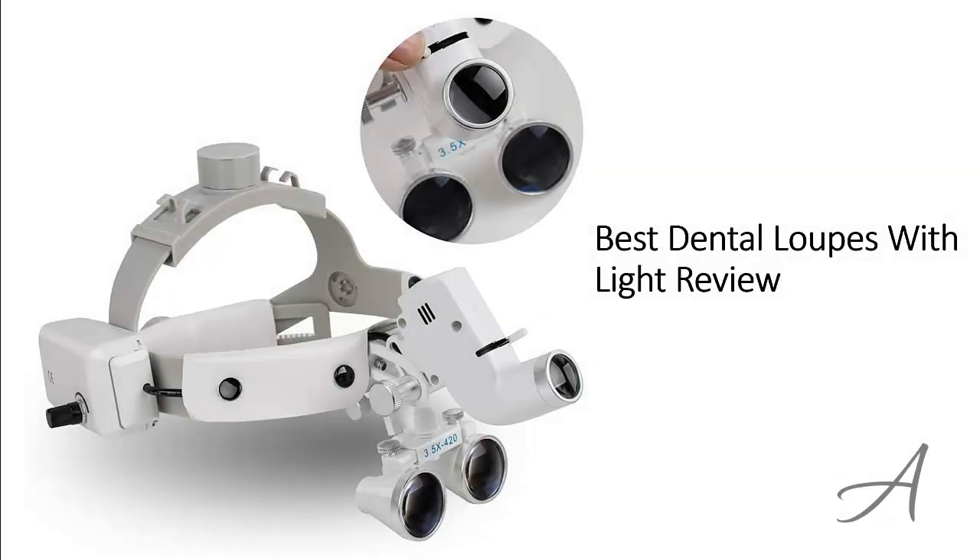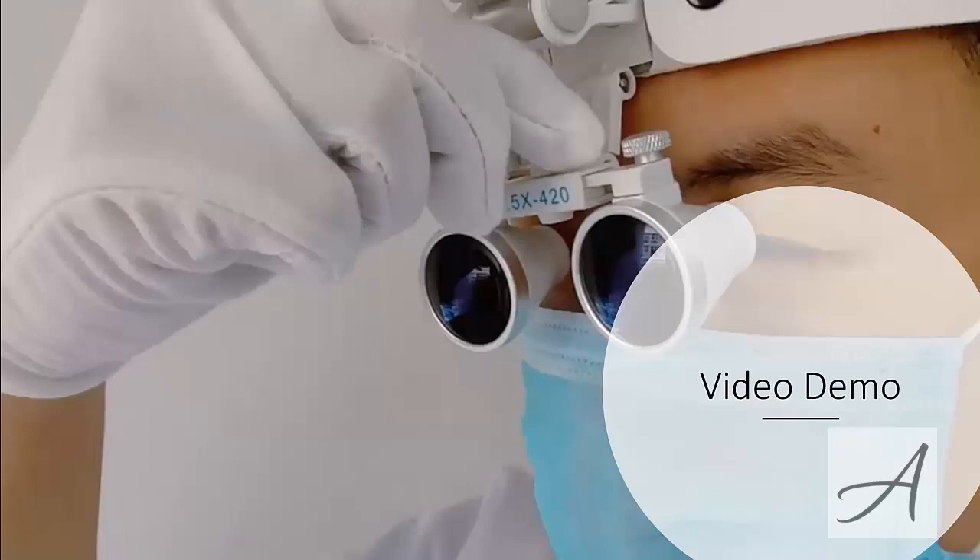Best Dental Loops with Light Review. In this video, we will share with you one of the most popular dental loops in the market that have been used by thousands of dentists who have given their stamp of approval. We will share with you some of the features of what makes this dental loop so popular, and you get to see a quick demo of how easy it is to use.